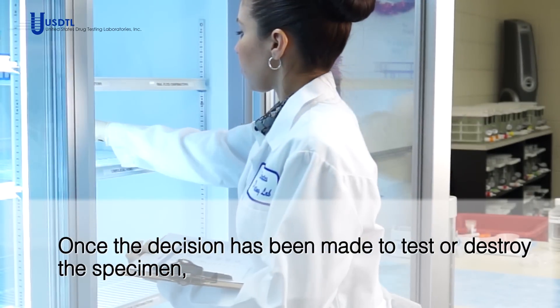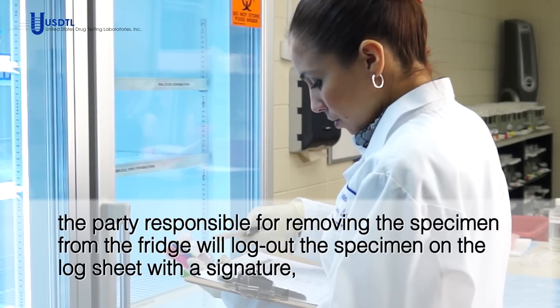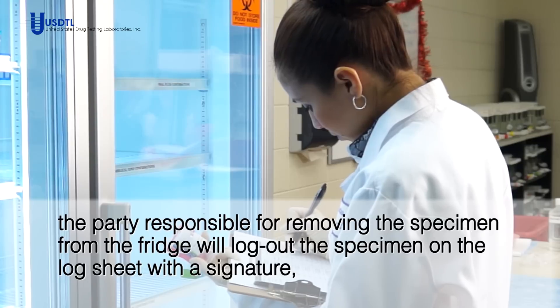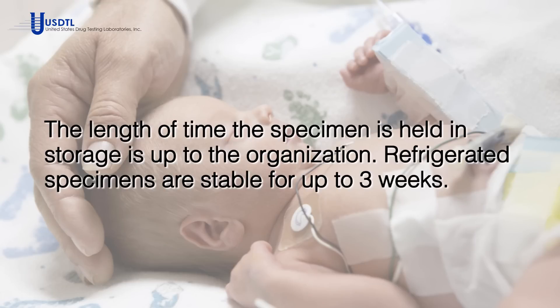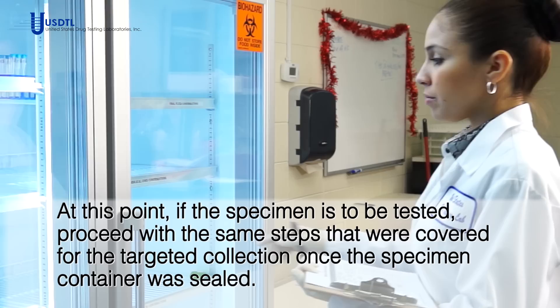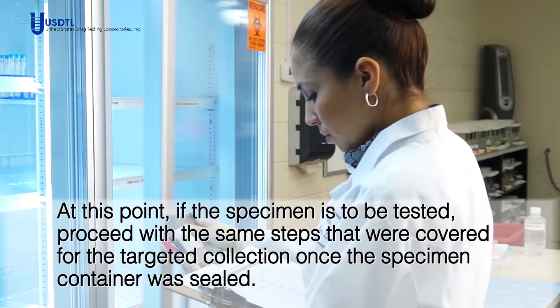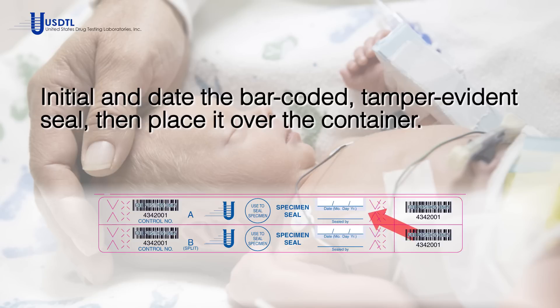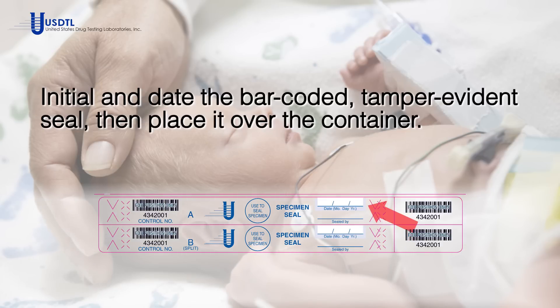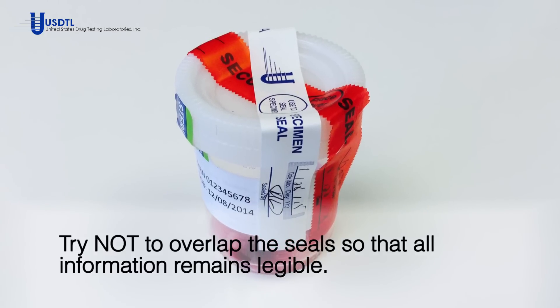Once the decision has been made to test or destroy the specimen, the party responsible for removing the specimen from the fridge will log out the specimen on the log sheet with a signature, date, and time next to the specimen information. The length of time the specimen is held in storage is up to the organization. Refrigerated specimens are good for up to three weeks. If the specimen is to be tested, proceed with the same steps covered for the targeted collection: fill out the custody and control form, initial and date the barcoded tamper evidence seal, then place it over the container. Try not to overlap the seals so that all information remains legible.